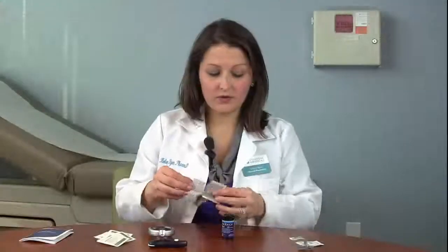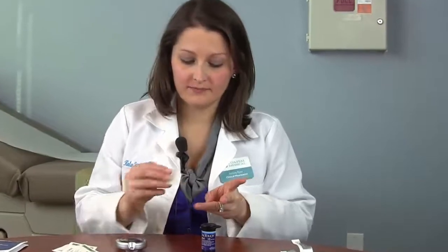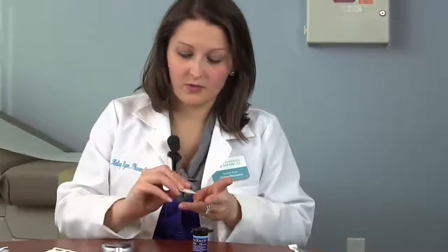After our supplies are set up, we'll be ready to prick our finger. But before we do so, we need to ensure that our hands are clean. You can do this either by washing your hands with warm soapy water, or today we'll be using an alcohol prep pad. We're going to check our blood sugar using the outside of one of our fingertips where the least number of nerve endings are located, so that is the area that we will clean with the alcohol pad.